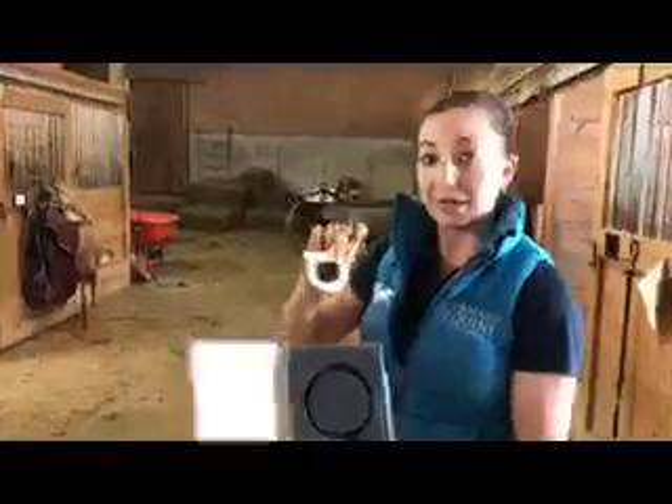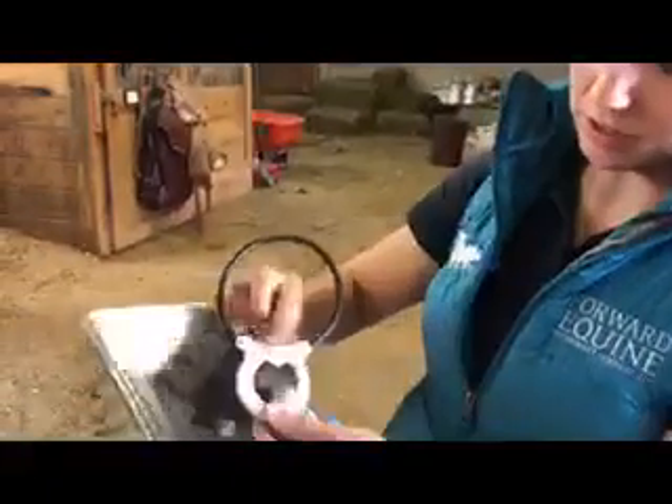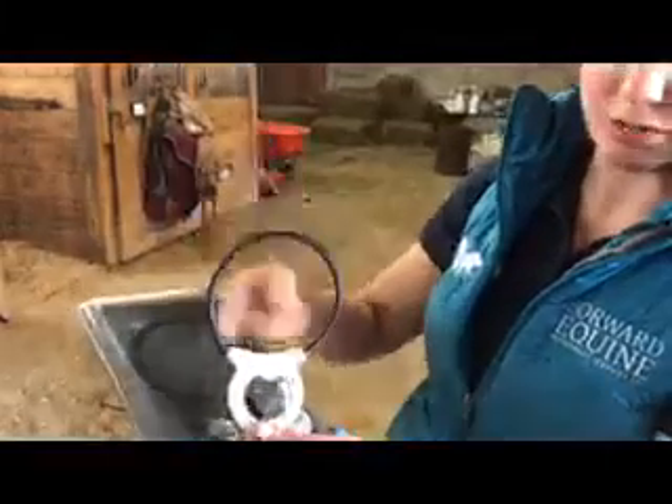It comes in a couple of sizes, but this is great for putting on legs, joints, small areas. It has a little button, and you just press the button and it goes for 15 minutes.